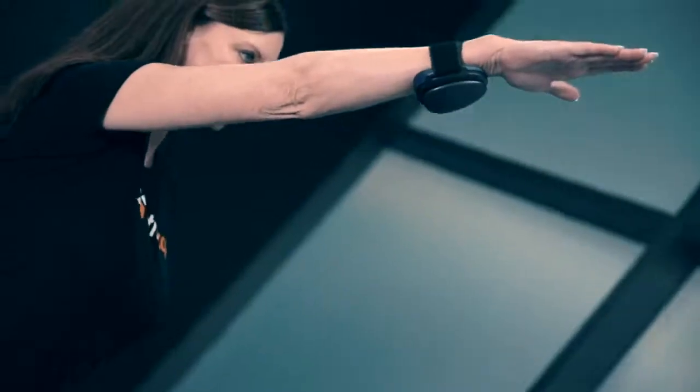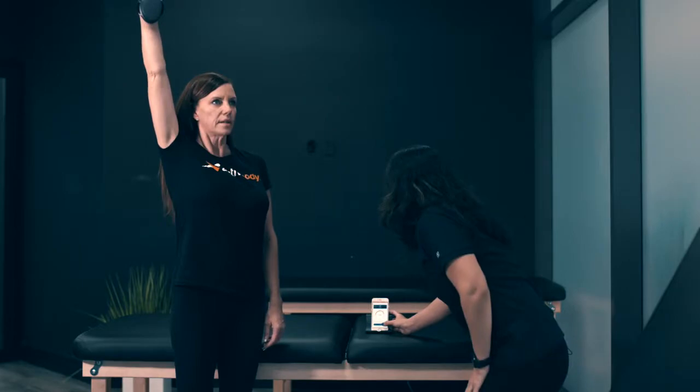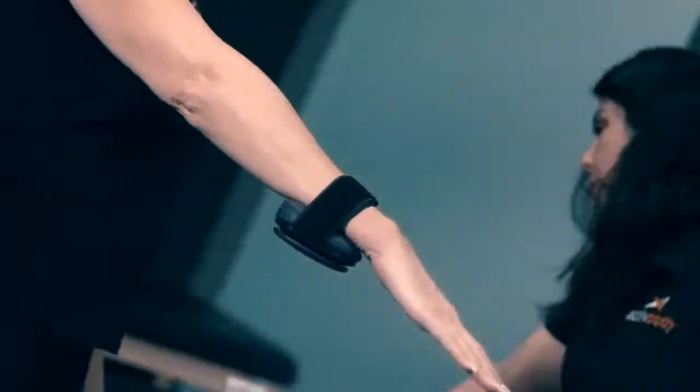It's going to calibrate for a few seconds. Go ahead and put your arm all the way up as high as you can. Stop when you have any pain or discomfort. And then we're going to end the test. That's going to be for flexion.